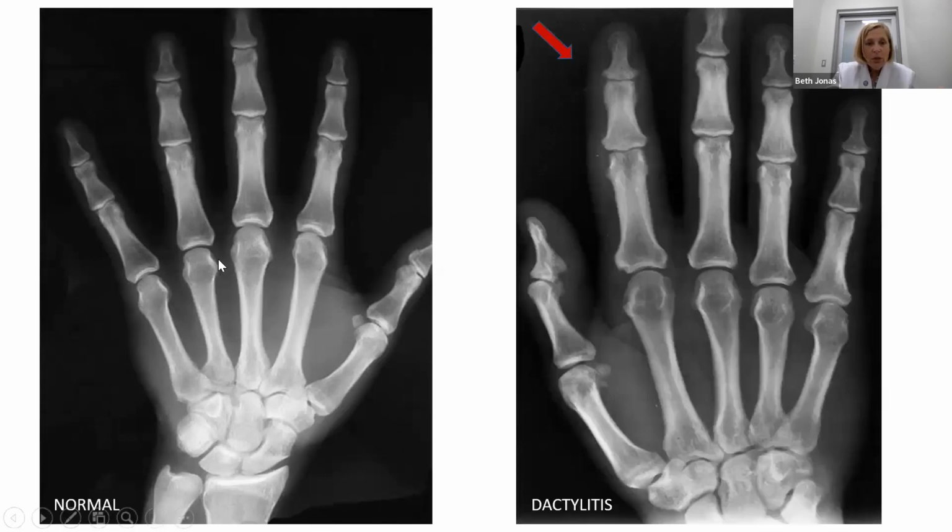This is a patient, left is normal, and on the right, there's soft tissue swelling really just around the index finger. You just kind of get the feeling like there's dactylitis. Also on this one, there's a little bit of an erosion.